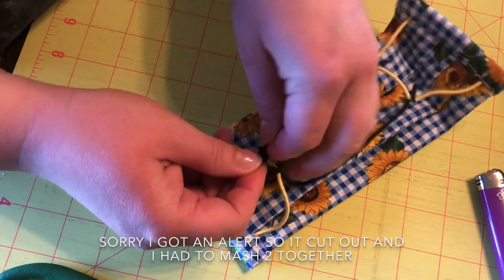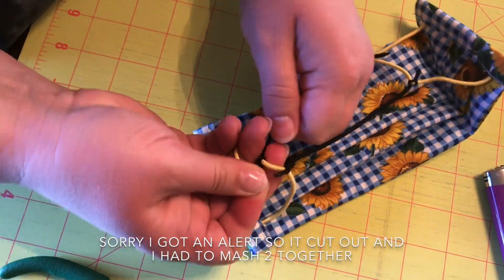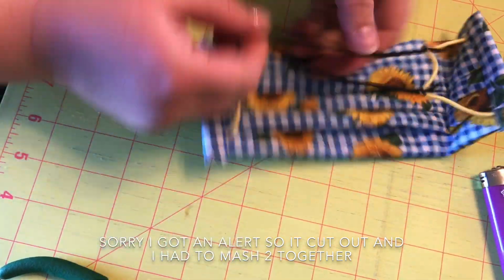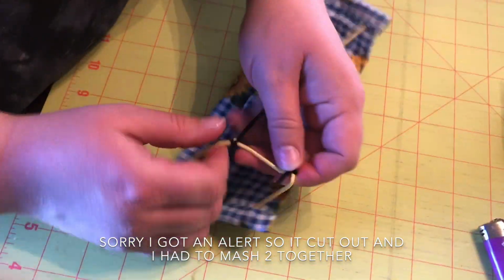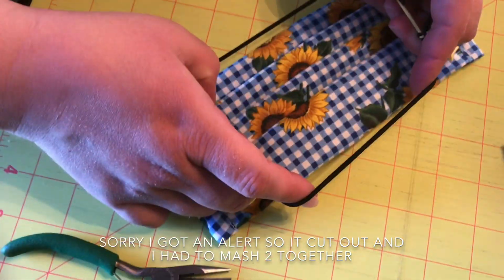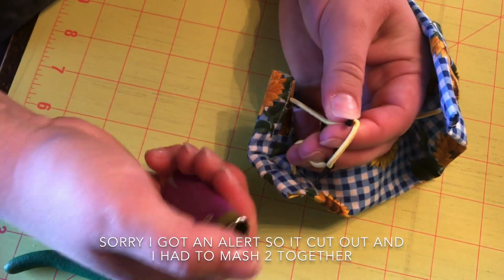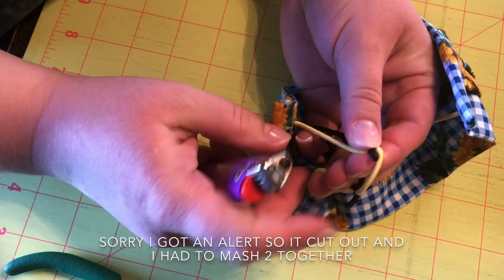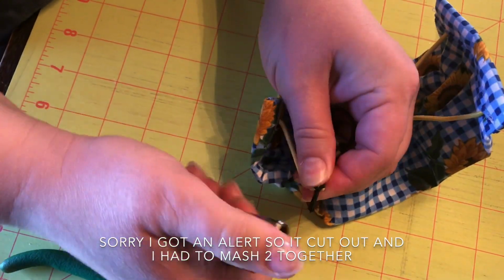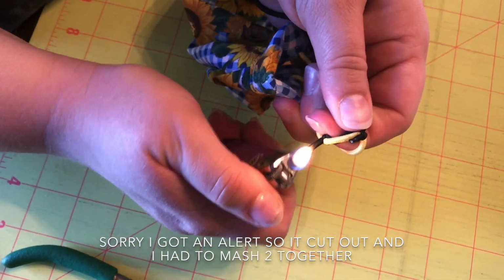Hold the end just a little bit with your finger and then bring the other one up close as tight as you can. Pull everything super tight. By having the 4 on there, it's going to hold it like up higher on your head and lower on your head. For most of the masks, this is working. Then I'm going to take with a lighter and just burn the edges really quick so they don't fray away.